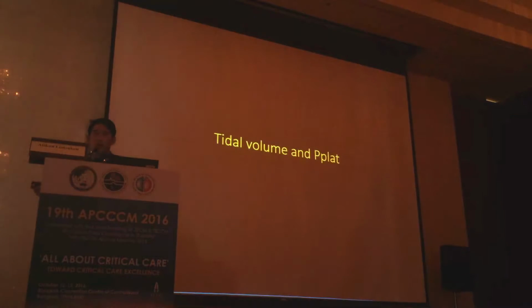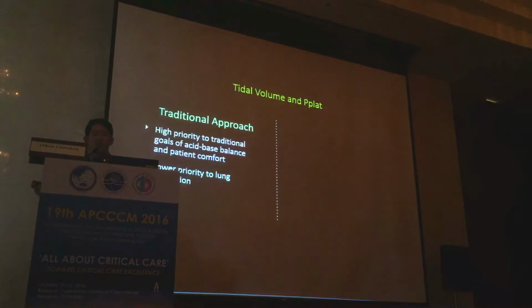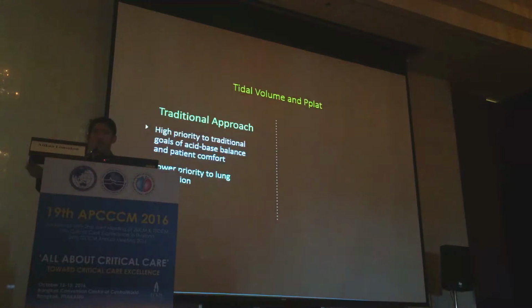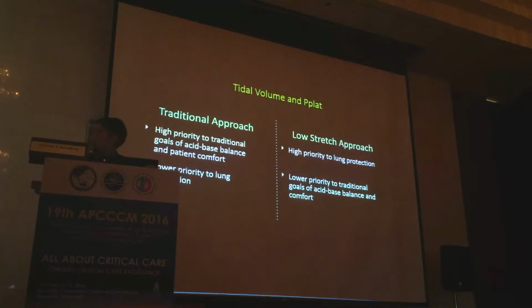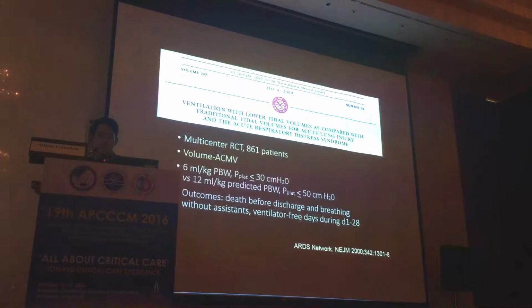So when we are talking about the tidal volume and plateau, we are moving from the traditional approach of the big breath that actually is more comfortable than the low tidal volume, and from trying to normalize all the gas exchange and keep acid-base balance and patient comfort, toward the more lung protective ventilation, which is a low stretch with limited tidal volume and plateau pressure.